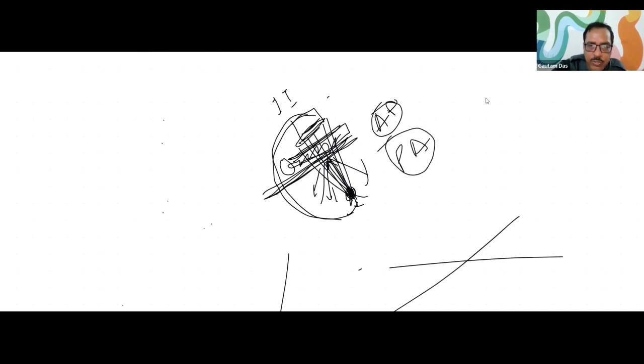The other views are the oblique view or lateral view. Lateral view also gives lots of radiation, so it should be as minimal as possible. You have to go for the lateral view, because without it you don't understand anything, so you have to check by the lateral view always, but that should be minimal. Maximum procedure should be done in the AP and oblique views.